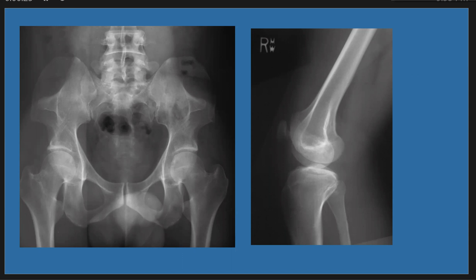This is a new case discussion. We are looking at the AP view of the pelvis and the right knee joint. We have pathology in these two X-rays. What do you see?